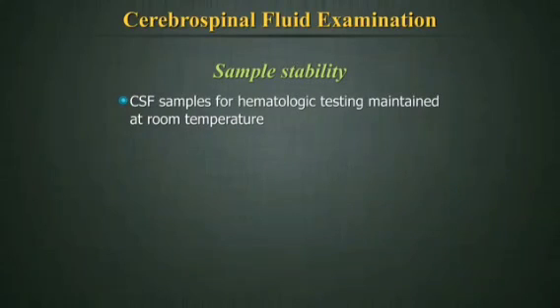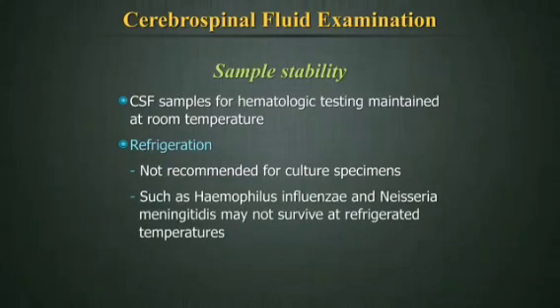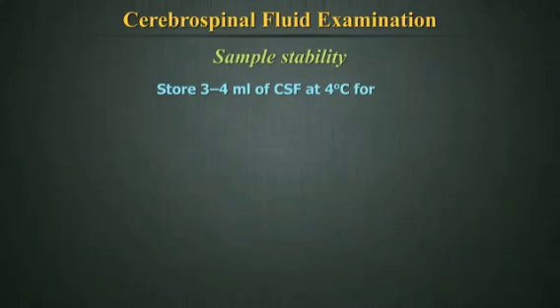CSF samples for hematologic testing should be maintained at room temperature prior to testing. Refrigeration is also not recommended for some culture specimens since fastidious organisms such as Haemophilus influenzae and Neisseria meningitidis may not survive at refrigerated temperatures.